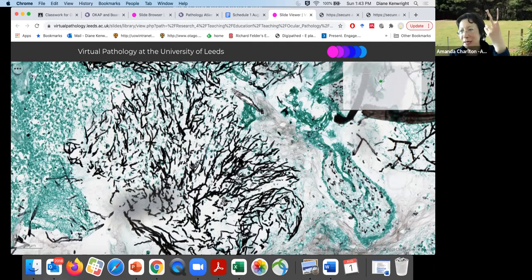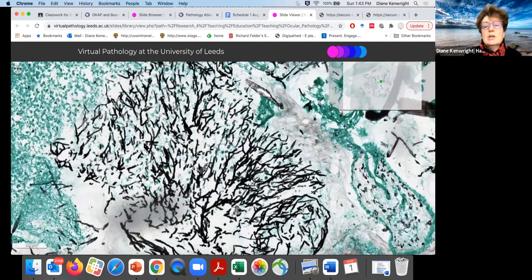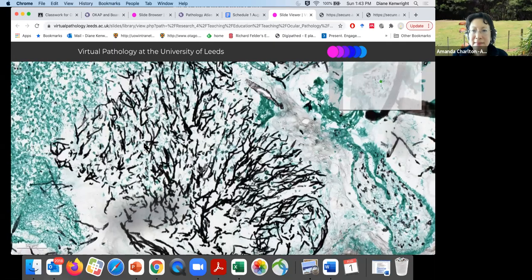So this looks like this one to me. So we've got 45-degree branching hyphae. Okay, so this would be Aspergillus. This is a typical growth pattern.